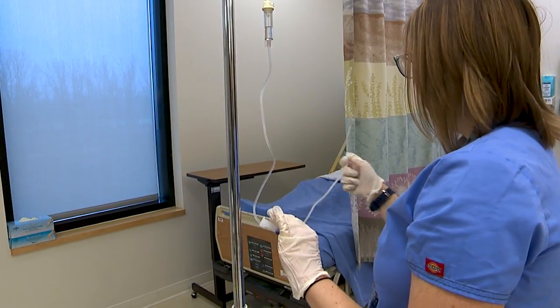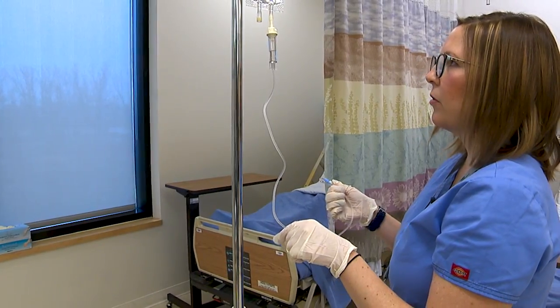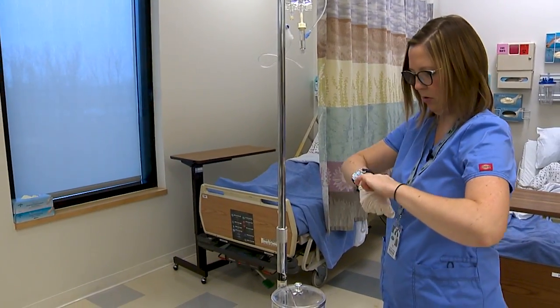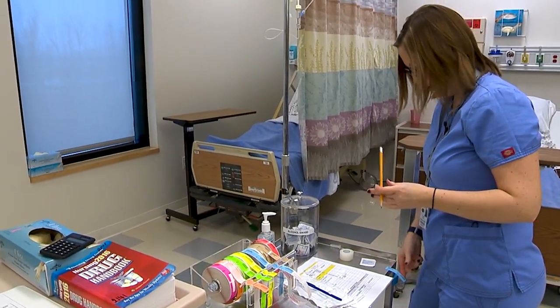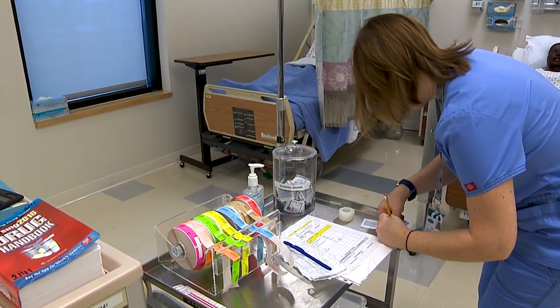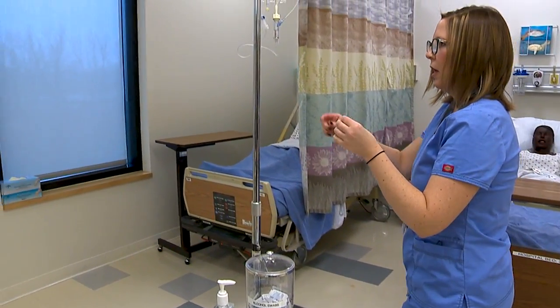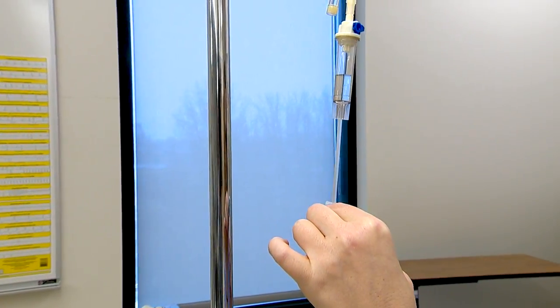Okay, looks good. I don't see any air. So now I can go ahead and get ready to go into my patient's room. I'm going to get my date sticker ready first. And again, you want to put the date sticker on the tubing and not on the drip chamber. Now I'm ready to do my third check.